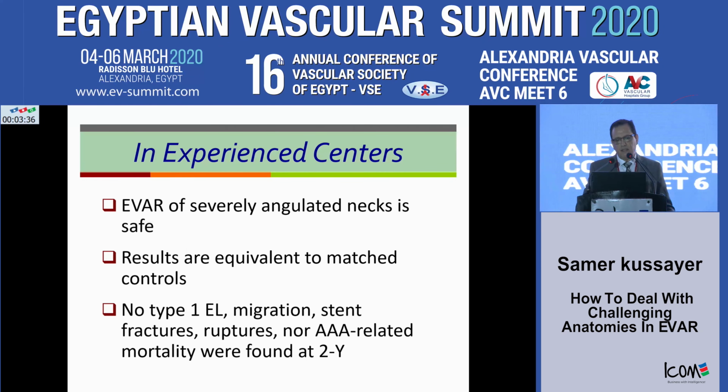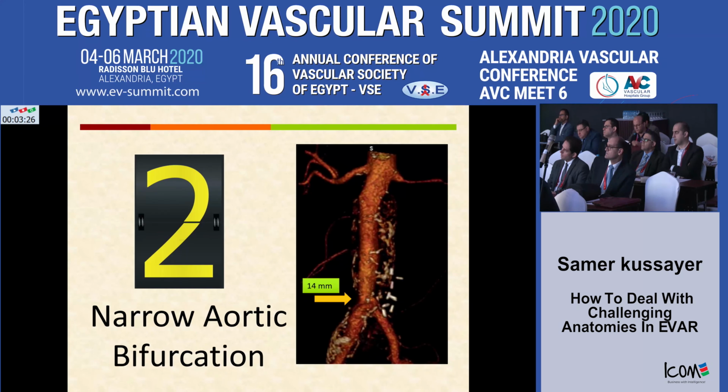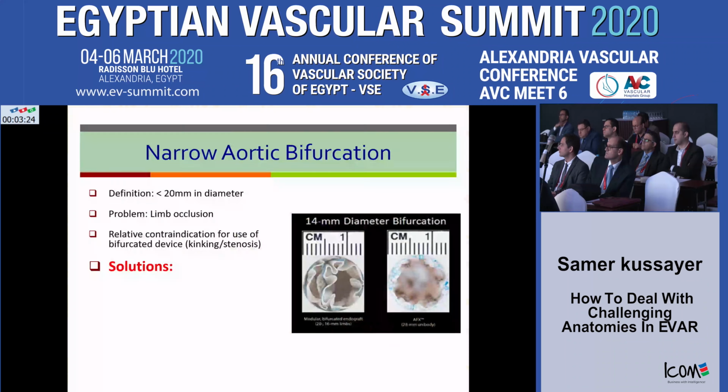In an experienced center, EVAR with a severely angulated neck is still safe, and the result is usually equivalent to matched control cases. So what is the second challenge during EVAR? You can have a narrow aortic bifurcation.